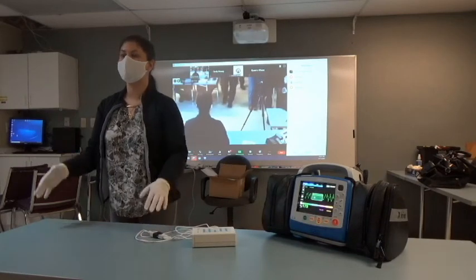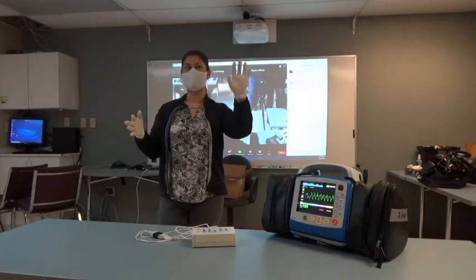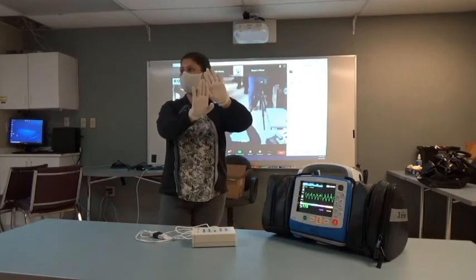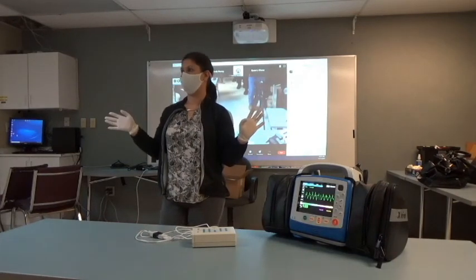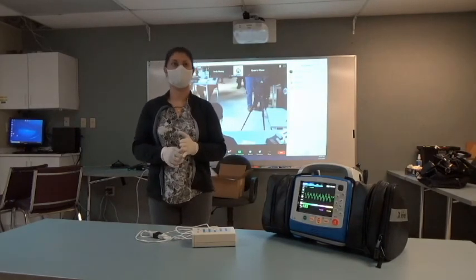So a couple of things. You've got a set of pads. I don't have a set of pads with me, but a set of pads that you guys are going to have, you're going to have a red pad and a purple pad. The red pad is going to have the CPR puck attached to it. This is a disposable system. When you're done, you throw it away. Do you want one to open up? It's up to you if you'd like. That'd be great. There goes the budget right away.